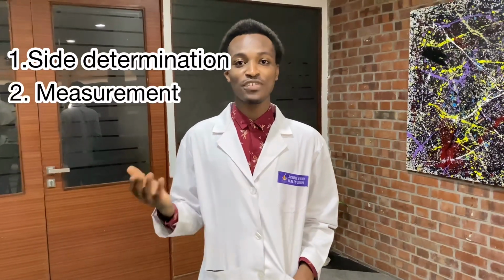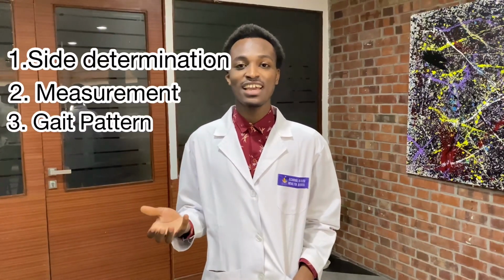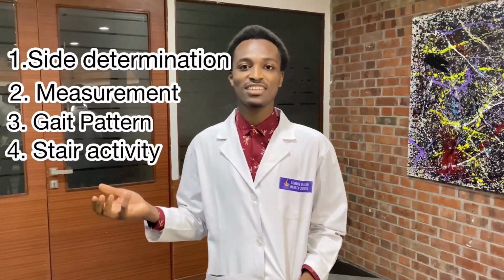In today's video, we are going to talk about walking aid, in which you will learn the side determination of cane, measurement of cane, gait pattern of cane, and stair activity with cane.